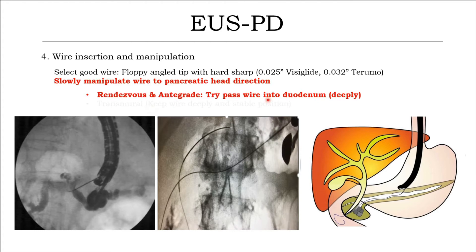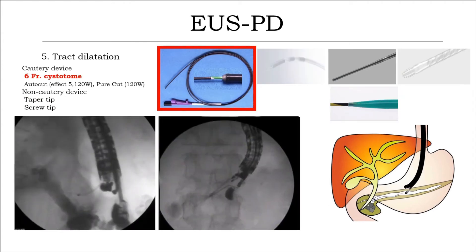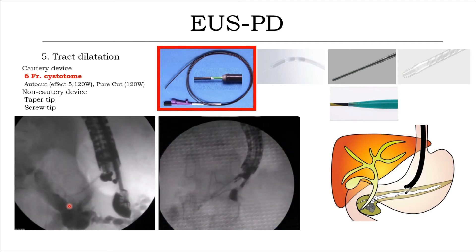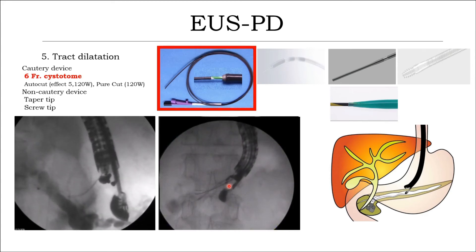Follow the guidewire with the dilator and try to pass the guidewire into the duodenum deeply. Step 5: tract dilation. The sequential dilation system is preferred, but sometimes multiple dilation devices are required for the tract because pancreatic parenchyma is very hard due to chronic pancreatitis. This example shows tract dilation with a cystotome and needle-knife. Sometimes combined dilation is needed — as you can see, the pancreatic parenchyma from chronic pancreatitis is very hard.